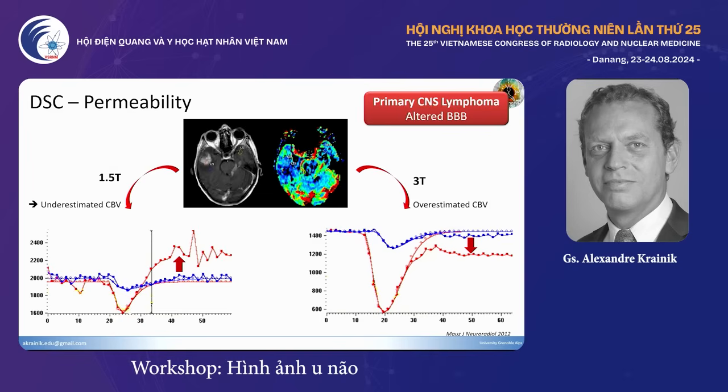out of the vessel. Then if you use a normal calculation to estimate the cerebral blood volume, you see when you have an overshoot over the baseline after the bolus, you tend to underestimate the CBV. If you consider that here is the entire volume where your contrast media was diluted, you underestimate the potential curve, which should probably be rather this way.